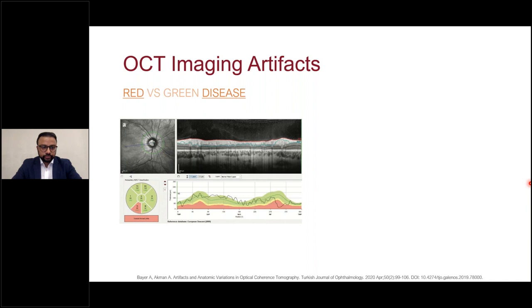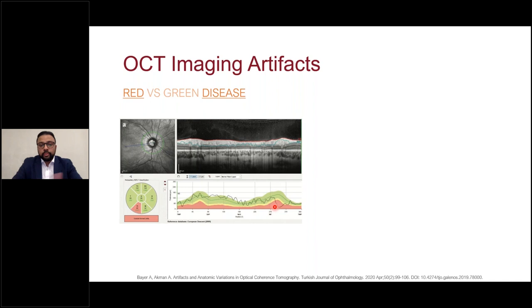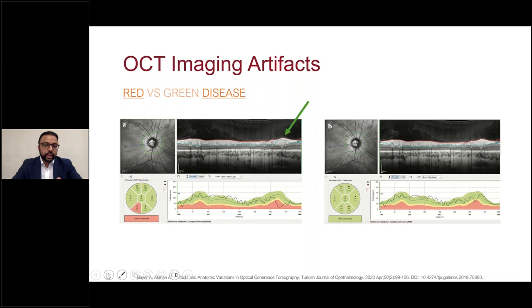Red disease is a false positive — a scan that looks bad but actually isn't. This can happen with high myopia, peripapillary atrophy, or simple segmentation errors. Here is a slide with an infero-temporal flag on the RNFL measurements, corroborated by the circumpapillary T-SNIT curve — it looks like glaucoma. But looking closely at the B-scan, there is a segmentation failure. If we correct that, this patient now has a normal-appearing nerve.